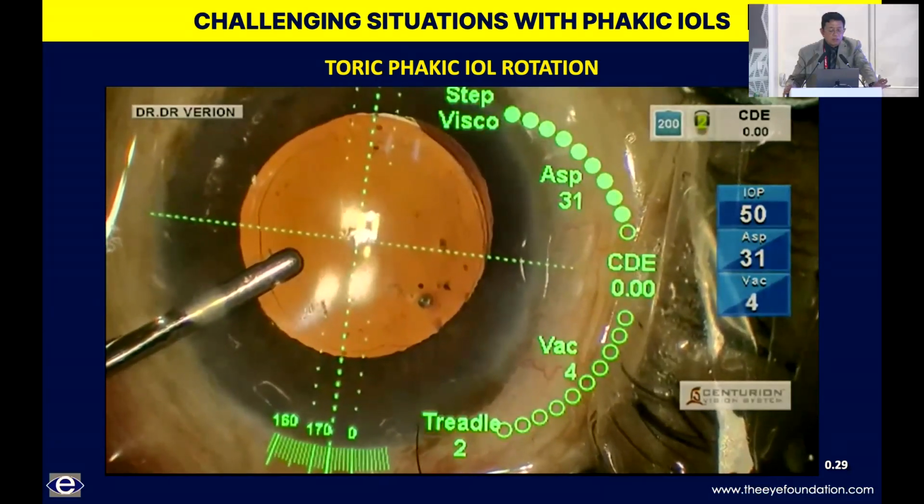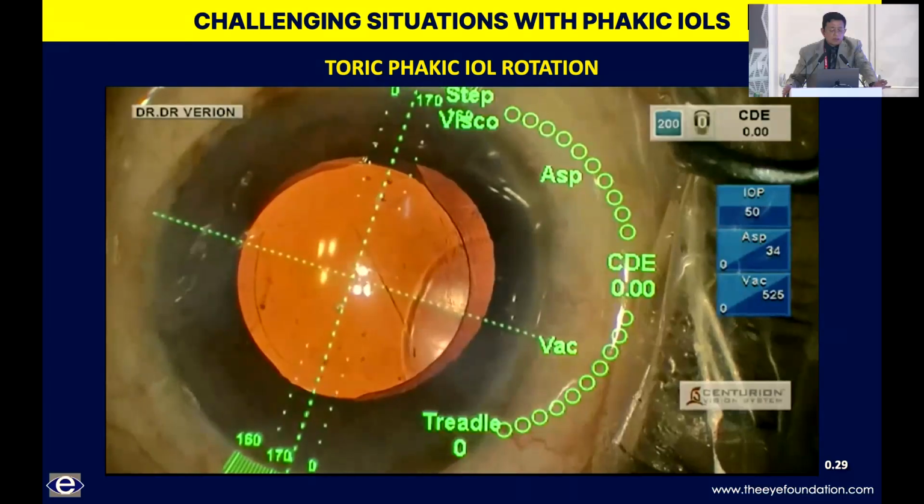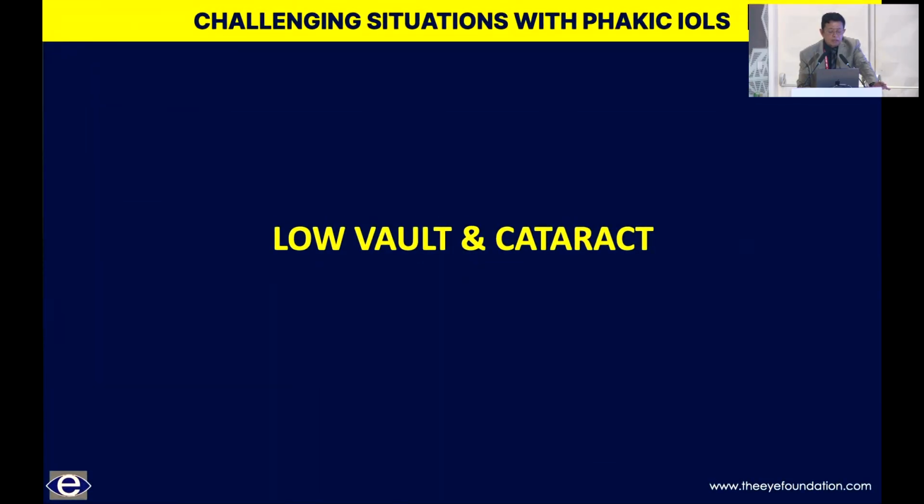And it's important that with these expensive technologies, you get the optimal outcomes as far as your patients are concerned. It's again a couple of minutes procedure, and just in case the results are suboptimal and the spherical equivalent is almost 0, do not hesitate to rotate these lenses.